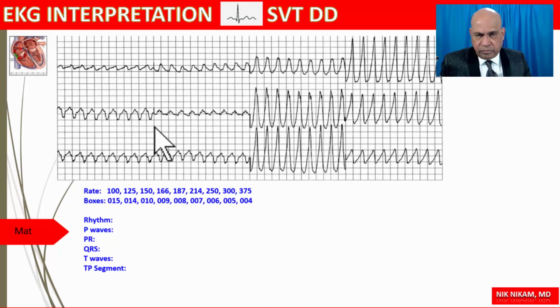If this is a P wave and we see what looks like a bundle branch block pattern, then it could be a regular supraventricular tachycardia at a rate of 187, which puts this in the rate of atrial tachycardia with one-to-one conduction and of course WPW. And whenever you see wide QRS complex regular tachycardia with possible P wave, you again think about the presence of WPW. Go back and see if this patient had an electrocardiogram before and see what the findings were.